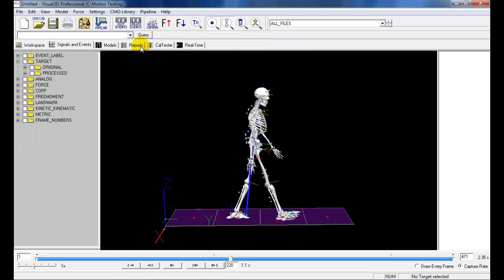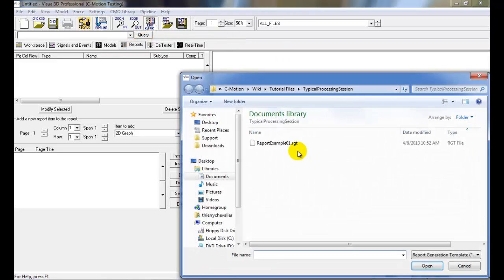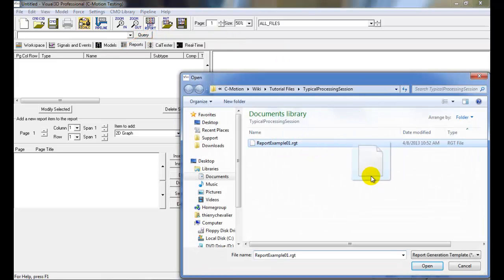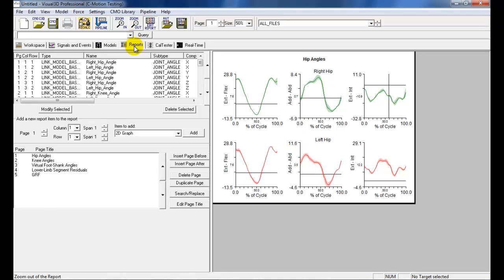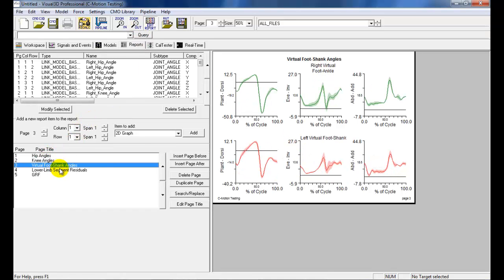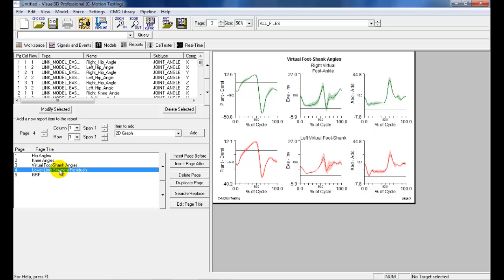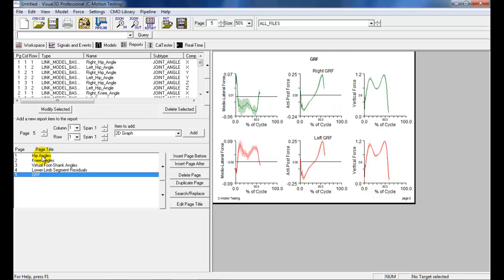We can now go to the Reports tab and apply a report template previously created. Select the correct RGT file and click Open. Because the model-based items stored in the ReCalc pipeline are saved within the report template, the graphs are automatically populated when the report is loaded.